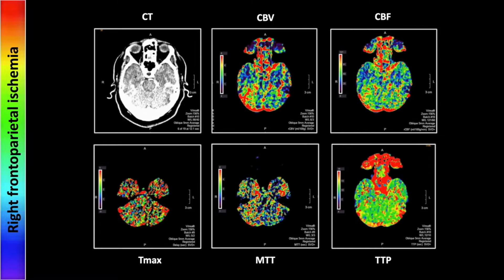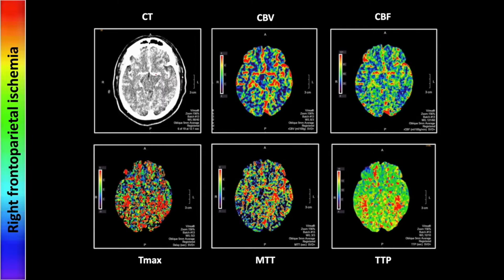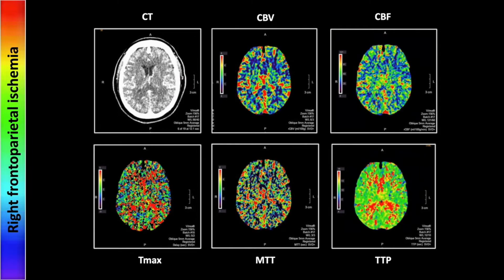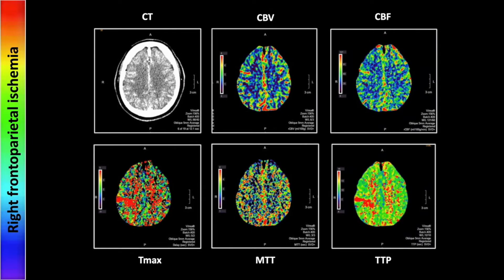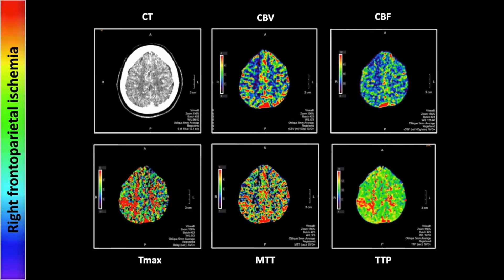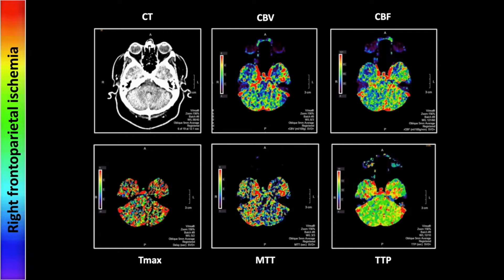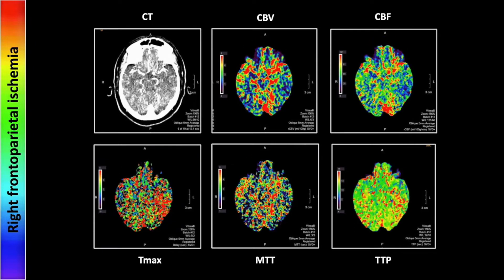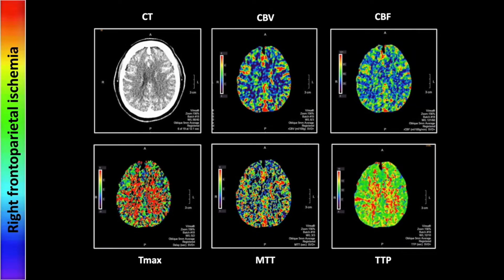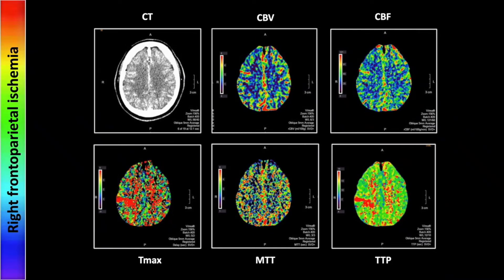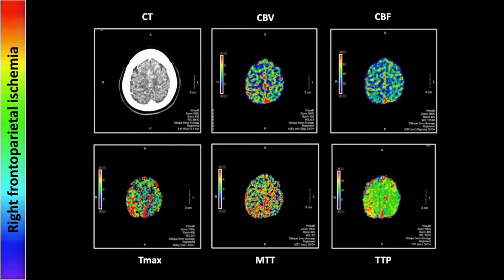So let's look at the cine images. The finding is subtle, though it is present on more than just the one cut. That is a case of right frontoparietal ischemia.